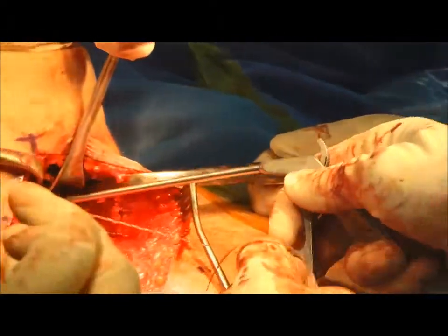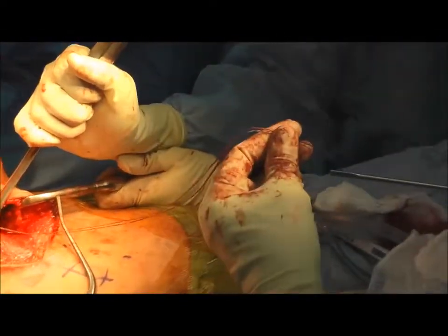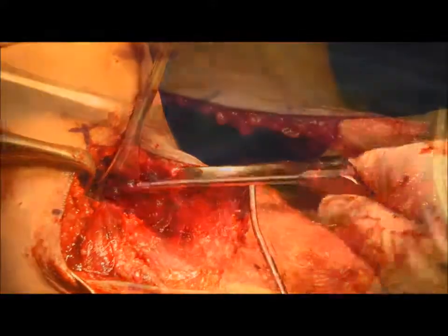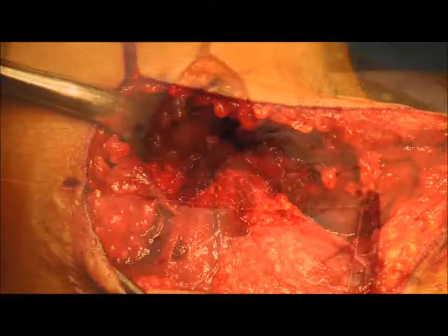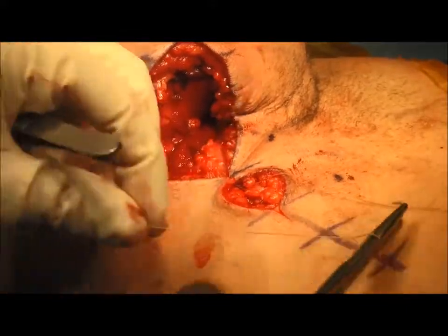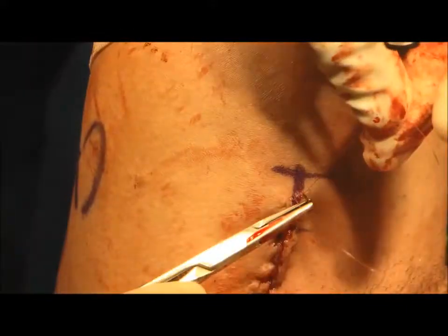Once tying is complete and the tendon is reduced, the sutures are cut short with an arthroscopic cutter to prevent irritation. The latissimus tendon is now repaired to its footprint. The wound is then irrigated and closed in layers, with 3-O Vicryl for the dermal layer and a running subcuticular 4-O Monocryl for the skin.